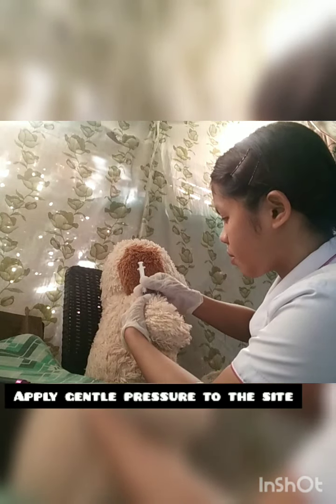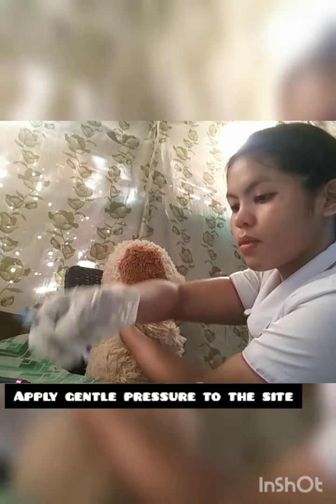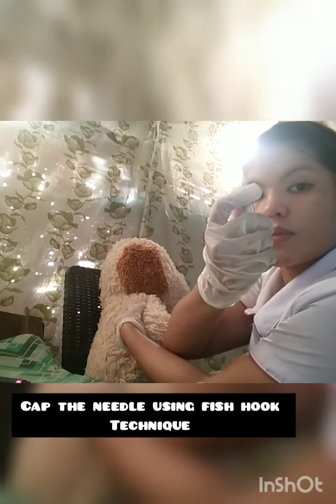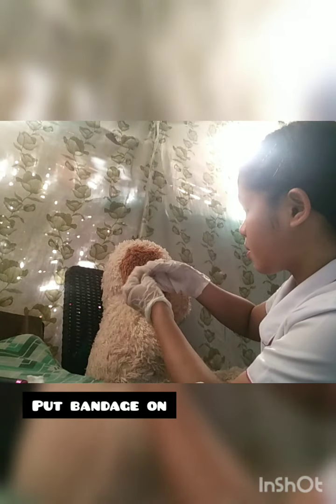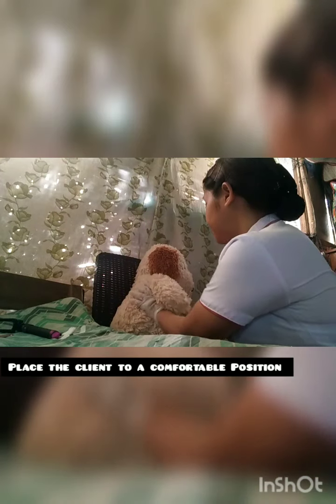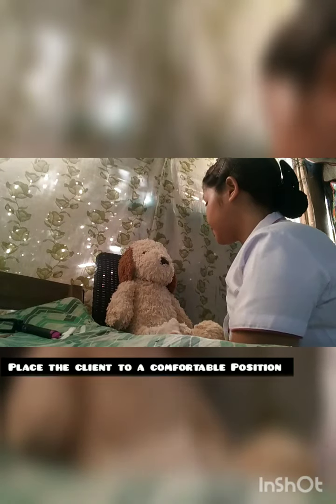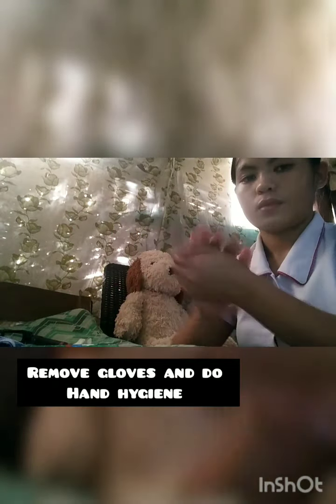Apply gentle pressure to the site and do not massage the site as it causes damage to the tissues. Cap the needle using fish hook technique. It is to prevent the needle stick injury. Put bandage on after. Help the client to a comfortable position. Remove gloves and do hand hygiene. It is to reduce the transmission of microorganisms.